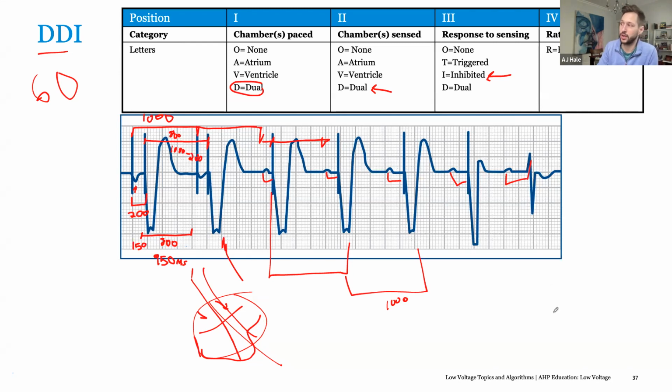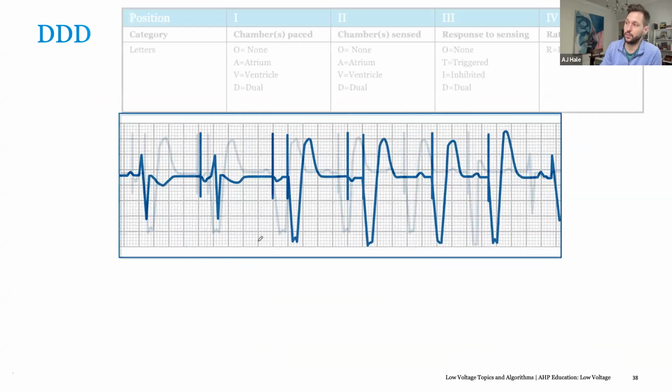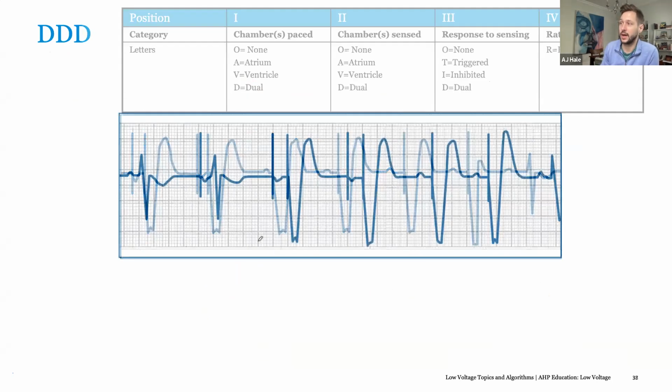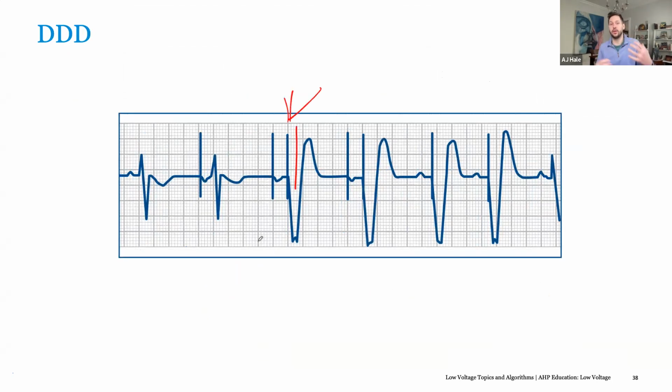And the argument can be made we're not optimized because this patient may have intrinsic conduction. So we're RV pacing them greater than 50% of the time, which is also not ideal. We don't want to pace them all the time. We could pace them into heart failure in 40% of those patients. So I think that's a really good point that you brought up: how do we decide what's best for this patient? I think you just have to have all of those factors in your head when you're optimizing a patient.